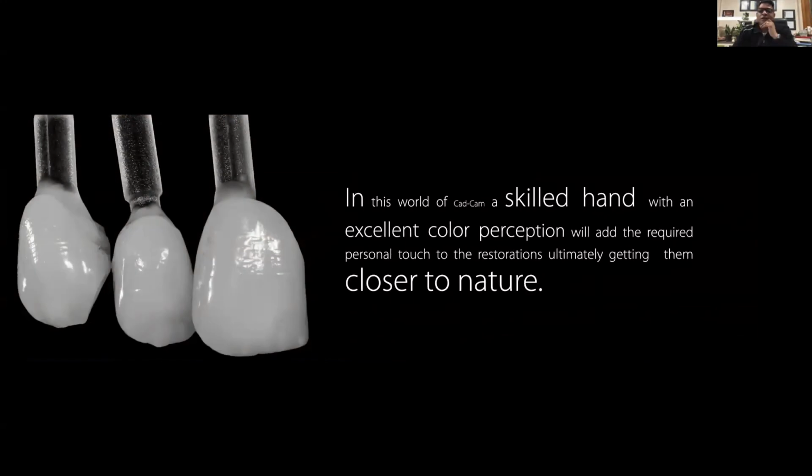So in this world of CAD/CAM, a skilled hand with an excellent color perception will add the required personal touch to the restorations, okay? Ultimately getting them closer to nature. So shape and color, you need to have the right information, you need to have the right study.